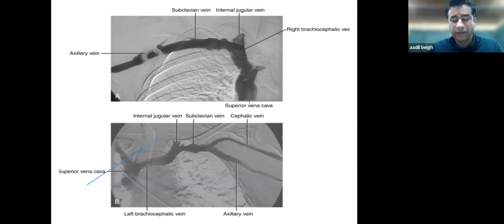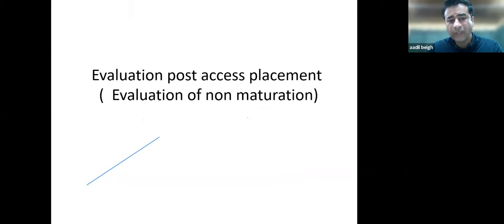You have to go for the Doppler ultrasound. Doppler ultrasound is very, very important. Or you can have the examinations. A lot of surgeons or nephrologists go with the examination only, but what all the studies have seen is that the Doppler gives you the insight of the vascular system before the placement of the AV fistula.